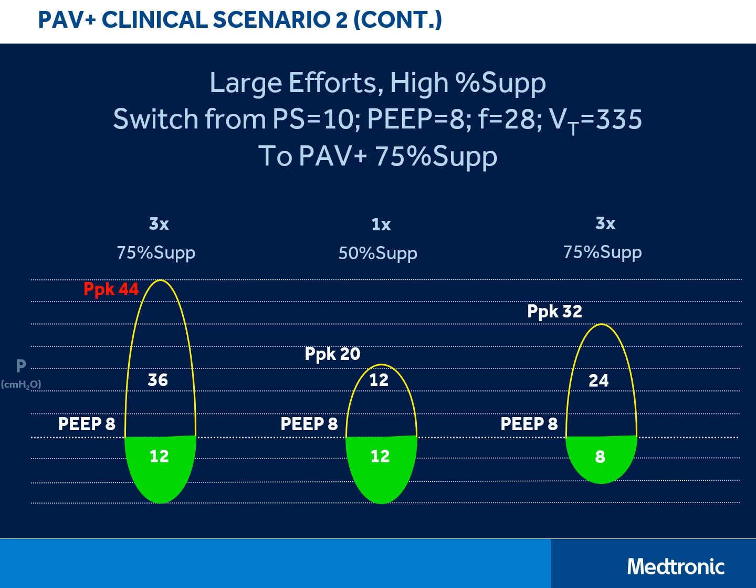A key point is that you want to make sure you set the high inspired tidal volume alarm and high peak pressure alarms appropriately, and then use an appropriate amount of support for the degree of patient effort during the startup.